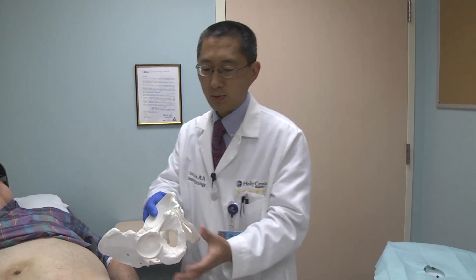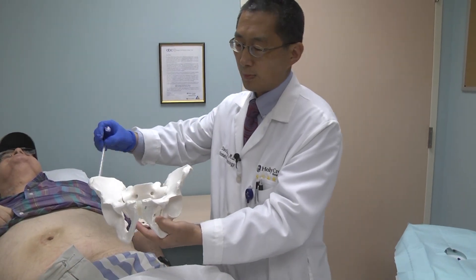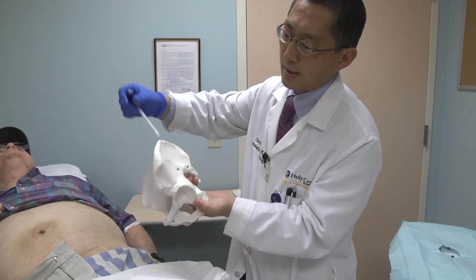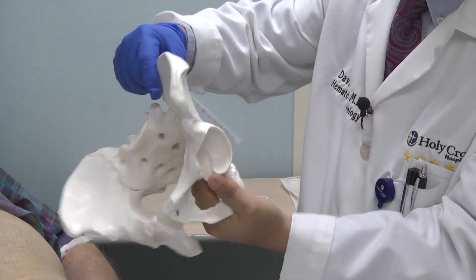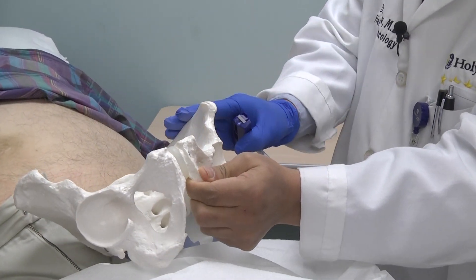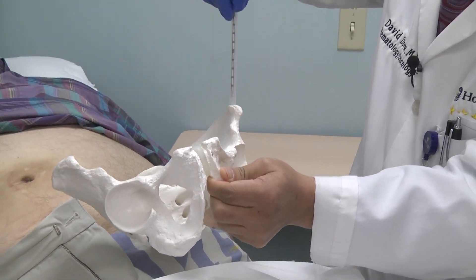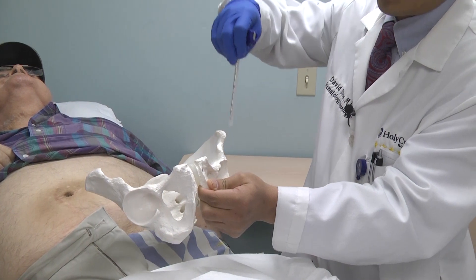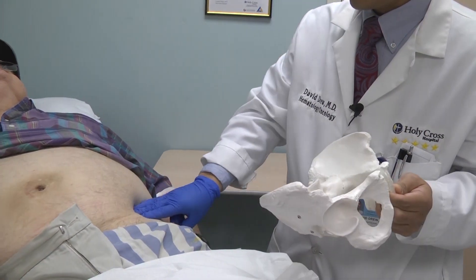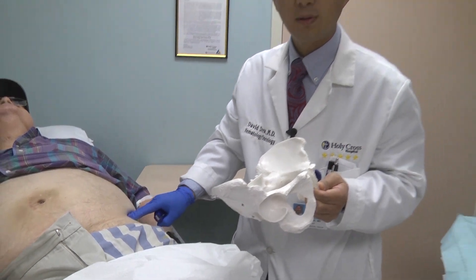From here, it's very important to get a feeling. The anterior approach and posterior approach are talking about the same bones from different angles. For this situation, we try to palpate the anterior iliac crest and then put a needle in this direction, getting into the bone. Over here, it's very close to the surface, so it's relatively easy even for overweight people.